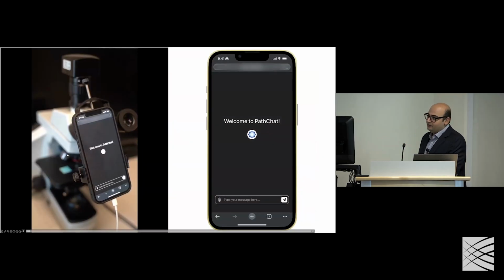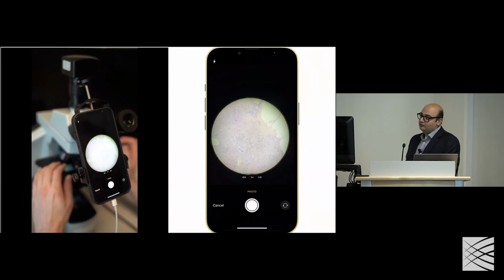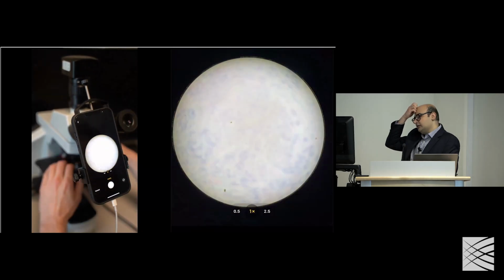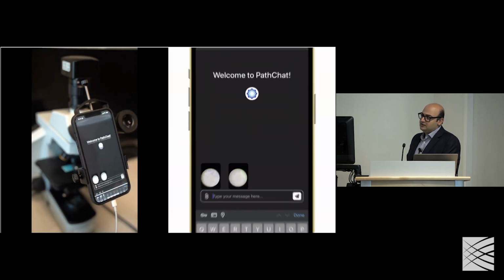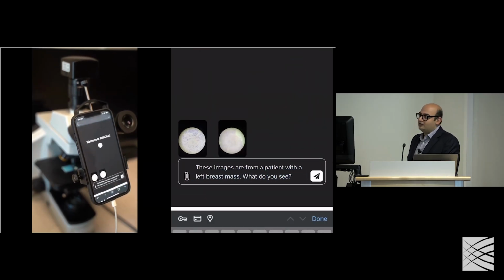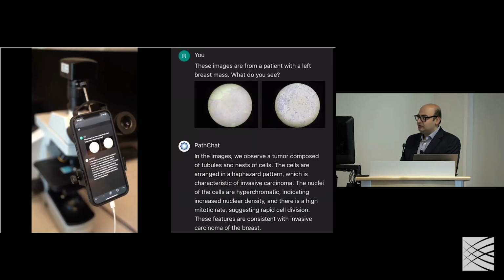We could also just couple a cell phone to a microscope. It's very common to do this in low resource settings. Pathologists often send their colleagues in more resource-rich settings images that are taken in this manner, so we can get responses right away. Some foundations that we work with are very interested in using this in lower resource settings to get immediate answers, because it's typically quite difficult for them to track the patient back once they've left the city where the hospital is. They can't just send the report over their phone. So this is also of interest in lower resource settings.